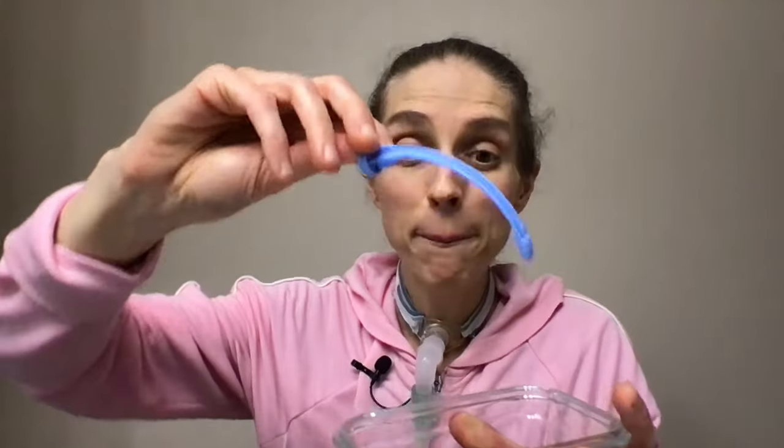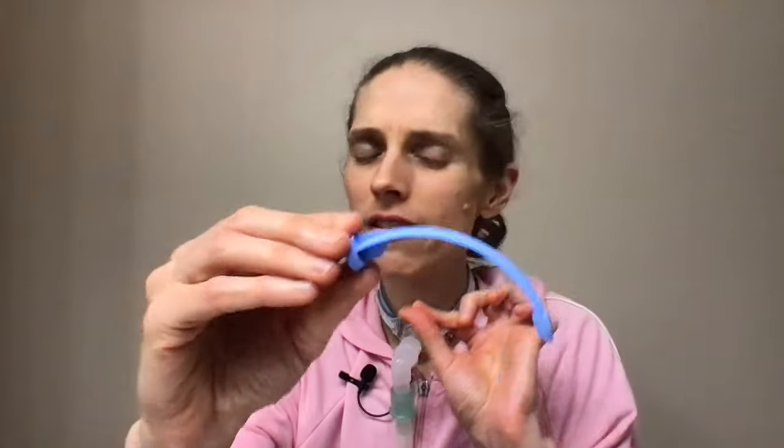Take a clean container. Take your obturator, set it inside. Take some soap and put it inside, and then put some hot water in there and swirl it around, and let this sit for 20 minutes, until it is safe to put your fingers inside. And carefully, when I say carefully, I do mean carefully, get this up, but only touch it at this rim. Do not grab it right here because now it is dirty. Please touch it by this rim. This rim will never go inside your tracheostomy, so you're safe to touch it with this.